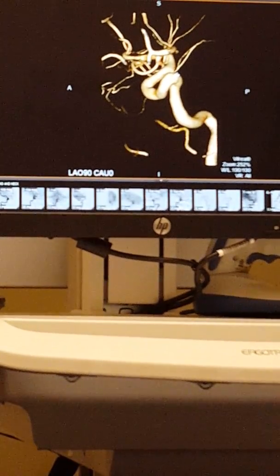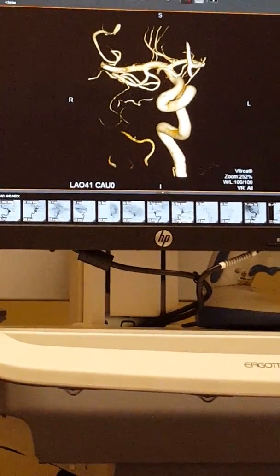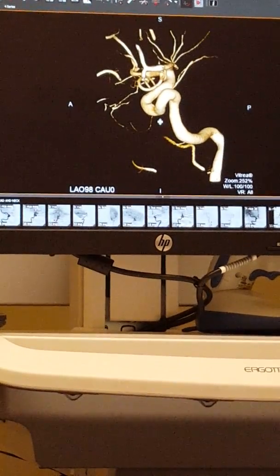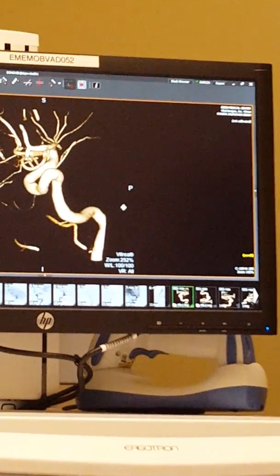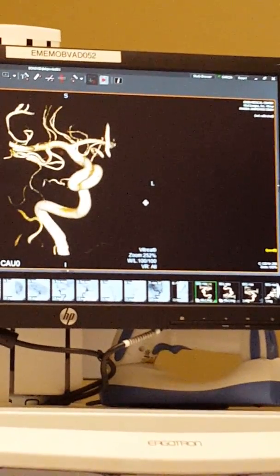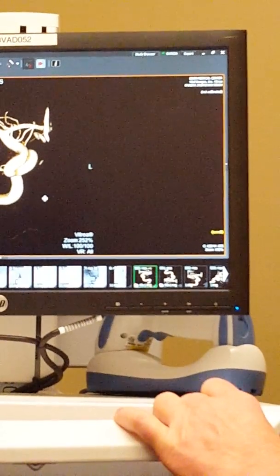And sometimes when you have something like this, it can look aneurysmal. Okay? Can I take a picture of that? Sure you can. I just want to show my husband, he's out of town. Oh, I see. You want to do a video of it? Yeah. Okay. Tell me when you're ready, and I'll spin it all the way around for you. Okay, then you can talk. Okay.